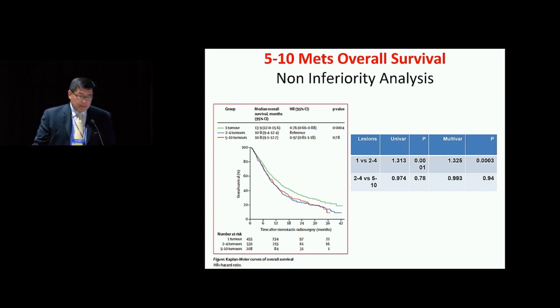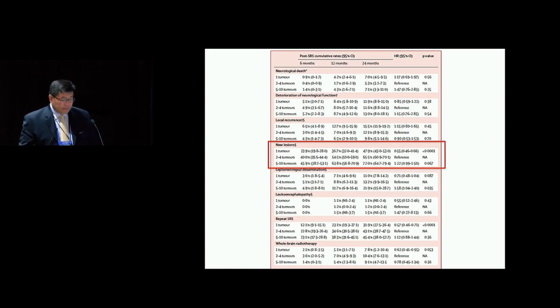And so it made us think, if we're comfortable treating 3 to 4 metastases with radiosurgery, and as a LINAC user, that's really all our clinic could tolerate, why shouldn't we be comfortable treating 5 to 10? Because oncologically, the dividing line for survival, for example, is really 1 or greater than 1. And this magic number of 3 to 4 metastases for radiosurgery, I think, was predicated more on practicality. It just was simply too intrusive into the clinic workflow to treat 3 or 4 isocenters one by one with a LINAC-based system. If you had a patient who had 10 metastases, you're basically taking up your linear accelerator for half a day. And it was just impractical. And so that limit, I wonder, came about not because of oncologic reasons, but mainly out of practical limitations of the technology. Here's an example from this paper.